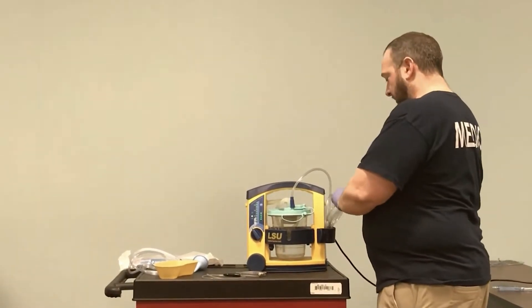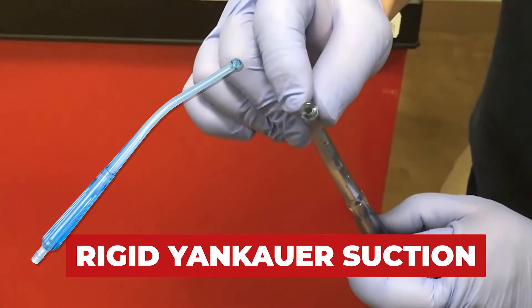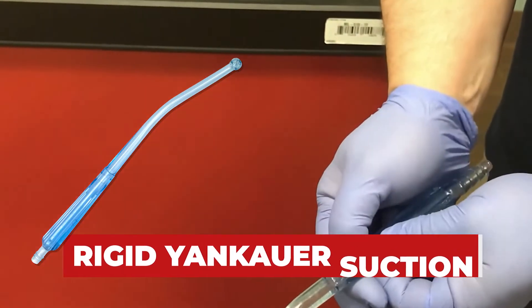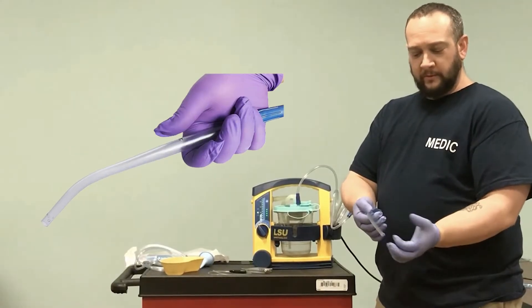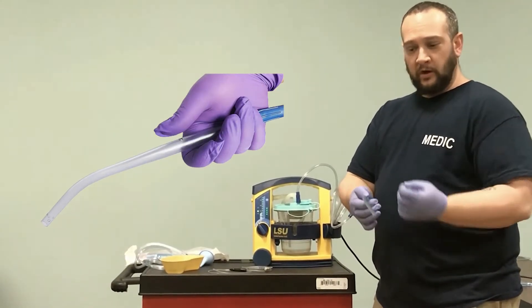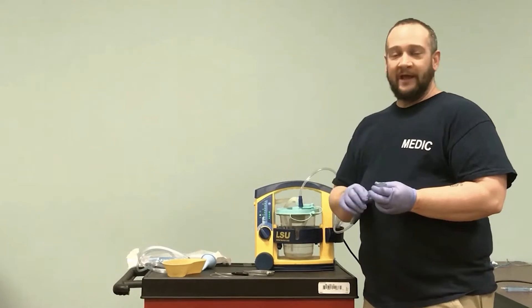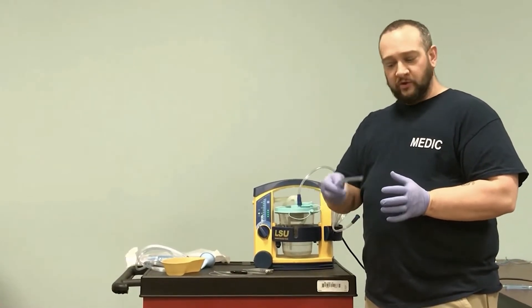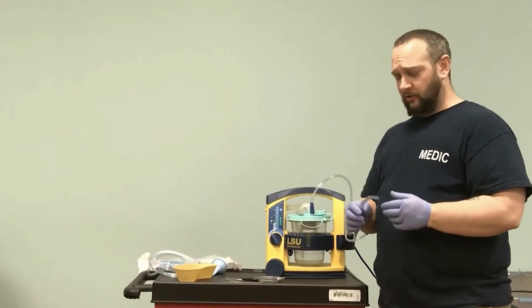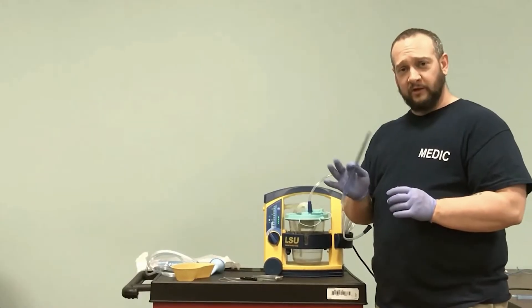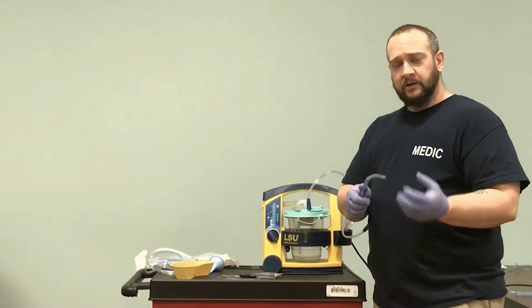We have our rigid Yankauer plastic suction device. This is firm, rigid plastic with a thumb port. When this end attaches to our tubing, we use our thumb to draw secretions through. It has a small internal diameter, so if we're looking at teeth particles or food, it isn't going to work well. Sometimes we can use this to scoop some of that out. The thumb creates the vacuum effect and we suction.